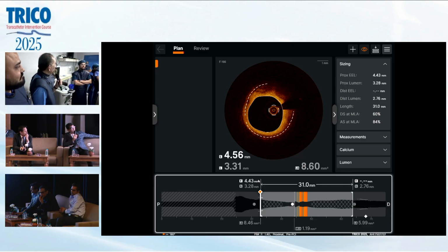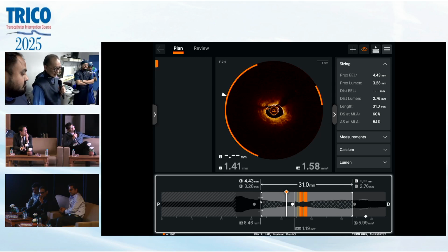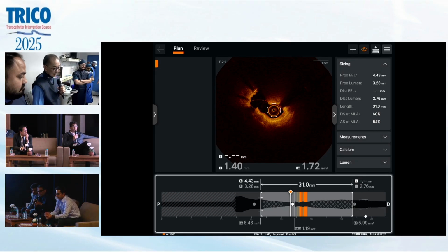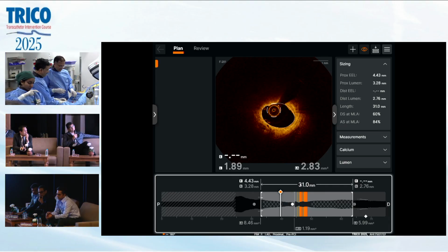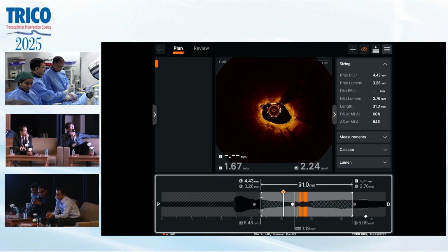But the question is, how can we prevent restenosis nowadays? Luckily this is a bare metal stent, so a drug-eluting stent will give better mileage already, especially when it looks more like intimal hyperplasia type soft tissue. So you can see some calcium here from 3 o'clock in between. My guess would be that DES will be more successful. Not a lot of calcium. It's a very soft area. Is there a utility of a scoring balloon or cutting balloon here with so much neointimal proliferation?